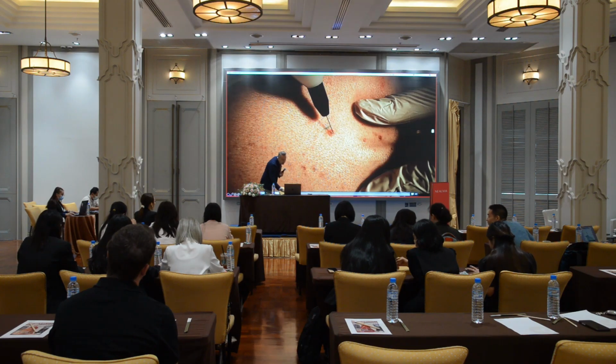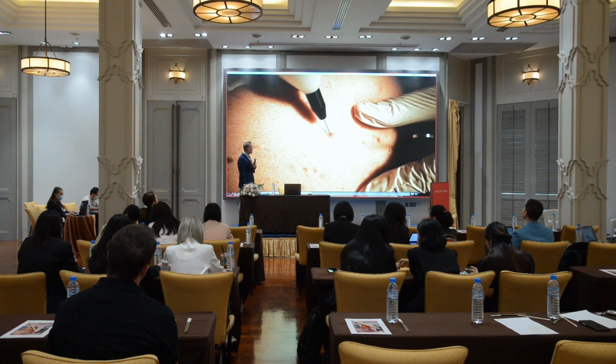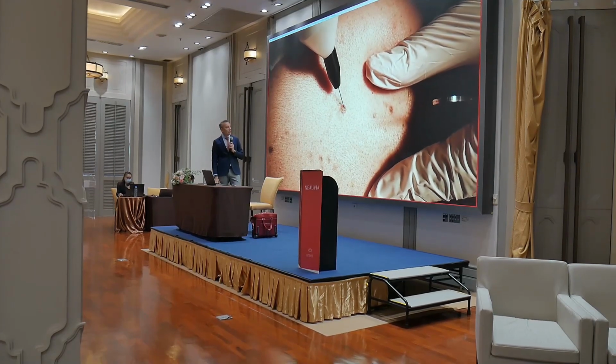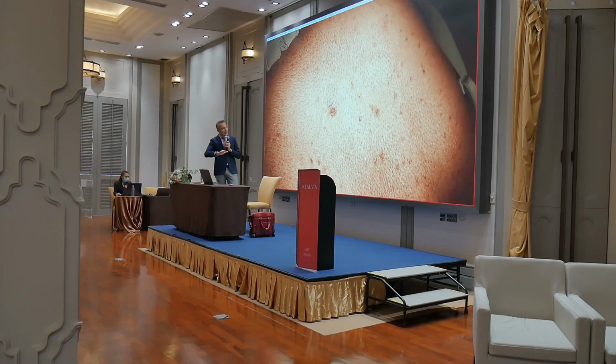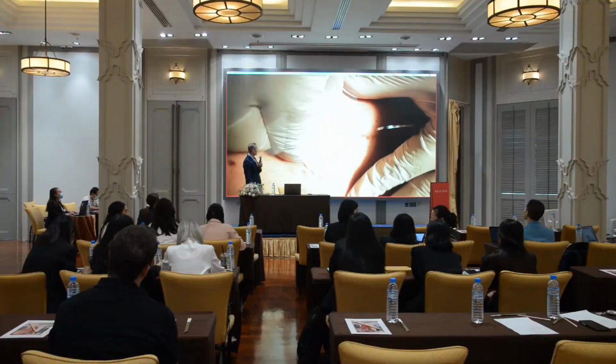This is an easy type to remove with the plasma. So you see that you eliminate, you go up to the papillary layers without any kind of bleeding.